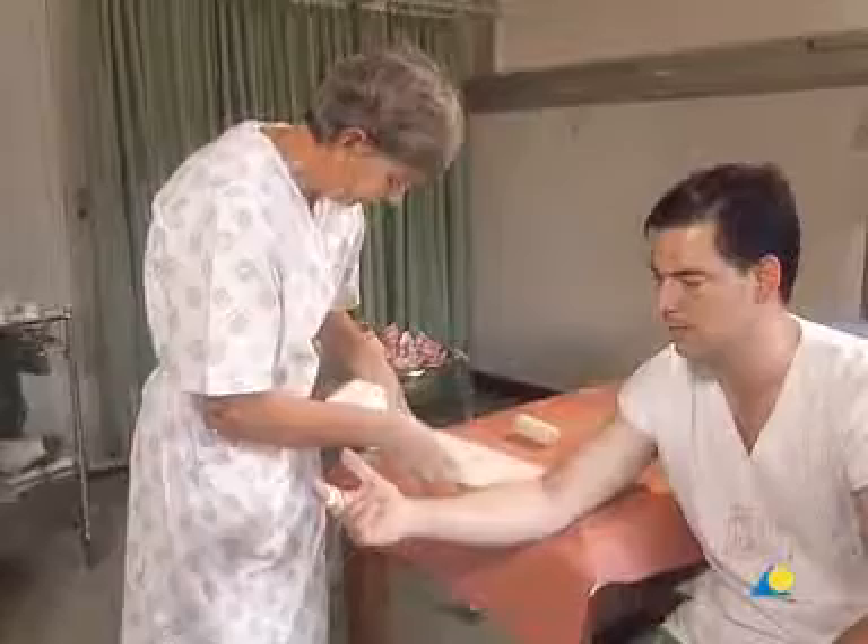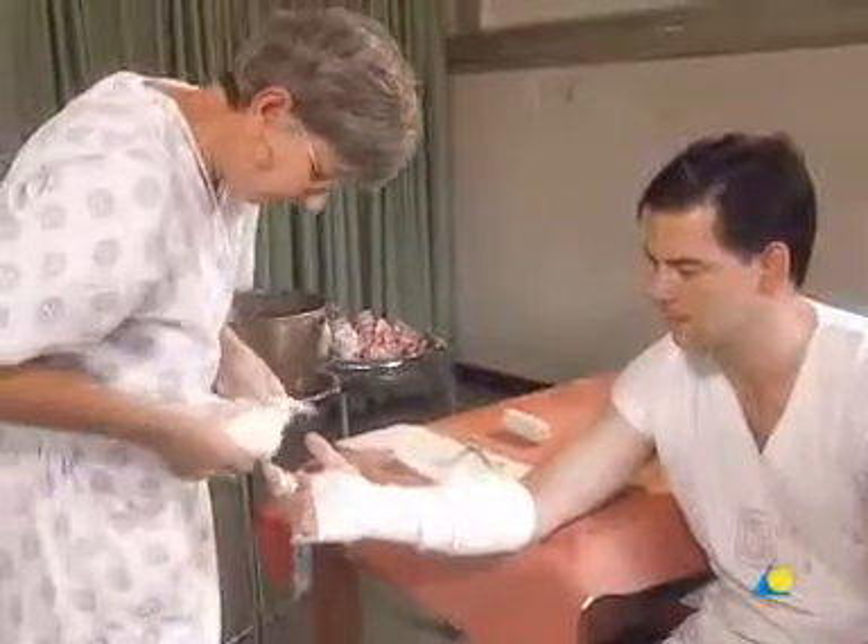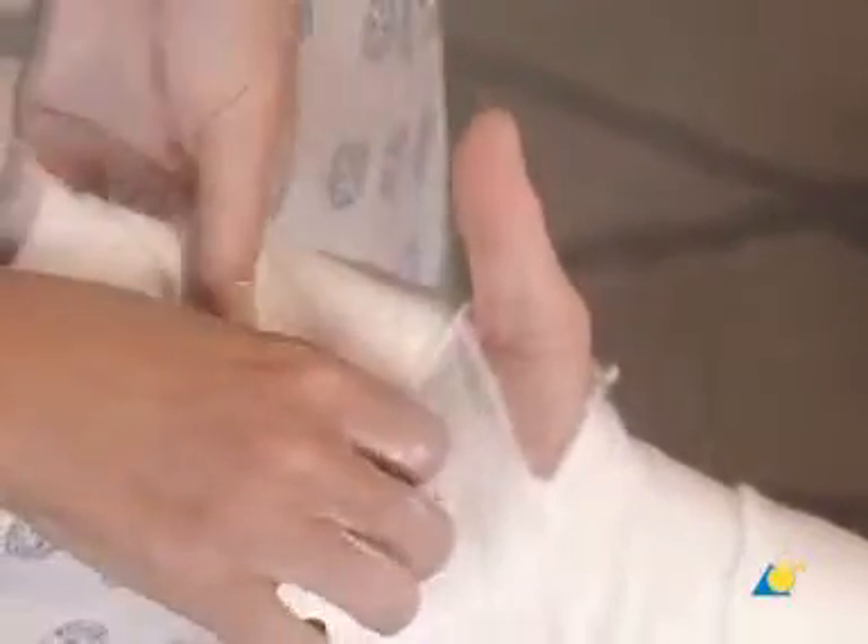The cotton wool will be used as undercast padding. A slit is cut in the cotton wool for the first web space. The cotton wool is gently wound on towards the elbow with an overlap of 50%. The 50% overlap creates a double layer of padding, which is sufficient in most cases. The proximal border of the radial gutter splint is about two fingers below the crease of the elbow. Additional cotton wool is wrapped around the second and third fingers and the metacarpal heads. The amount used should be sufficient to eliminate pressure points, but not to interfere with the molding.